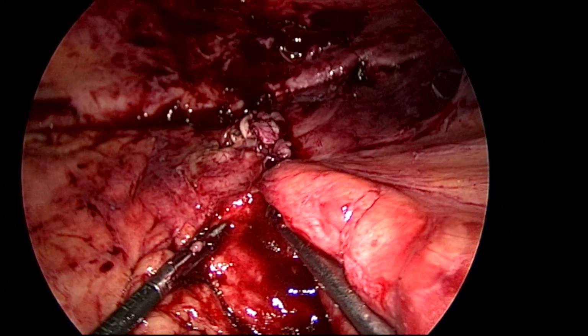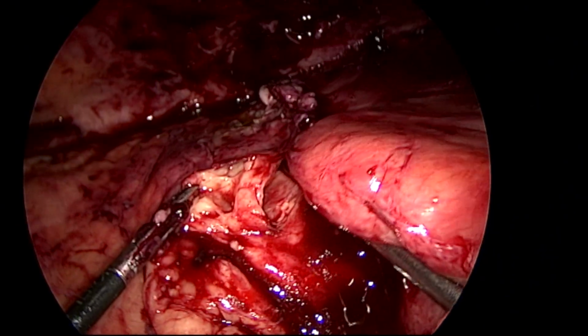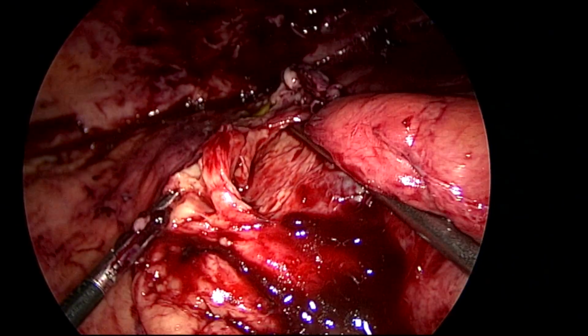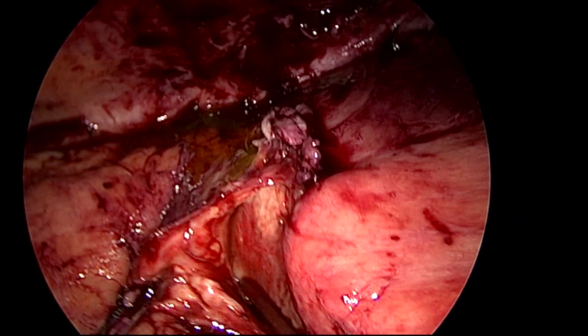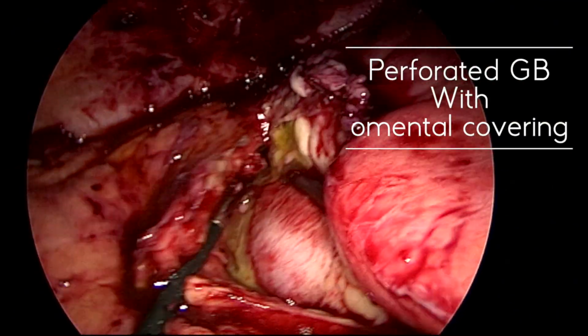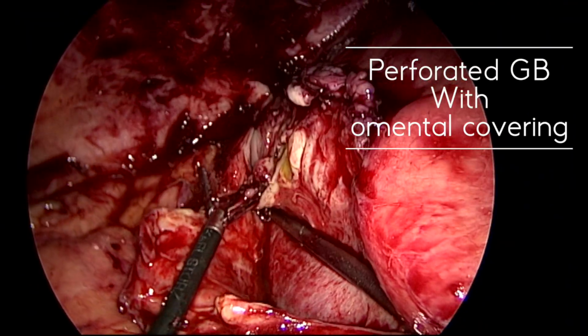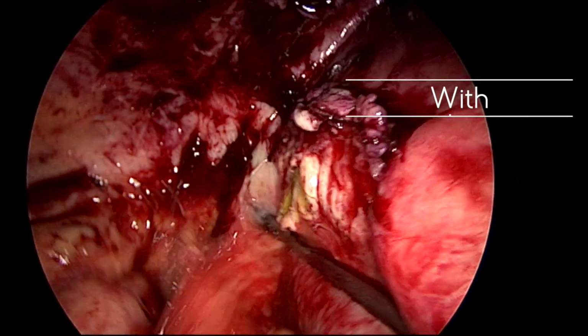So I'm trying for this because the falciform is densely adherent to the liver. So now slowly I could separate the omentum, so I could identify the gallbladder. That is the gallbladder. So you can see the perforated gallbladder with the omental covering. The fundus of the gallbladder got perforated. The very dense omental covering is there.